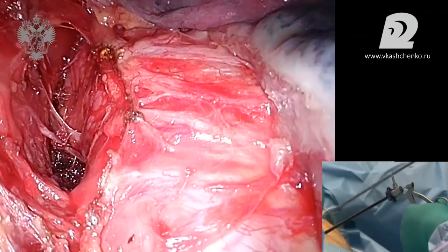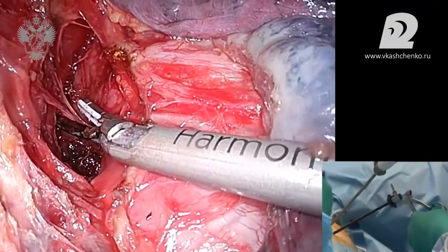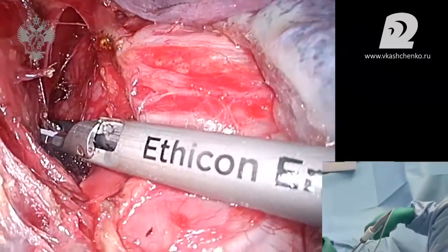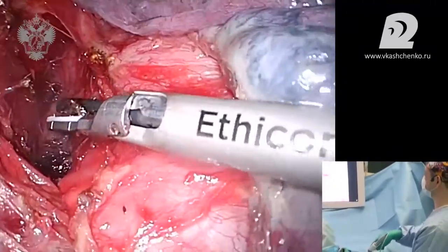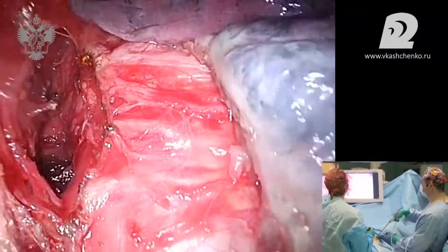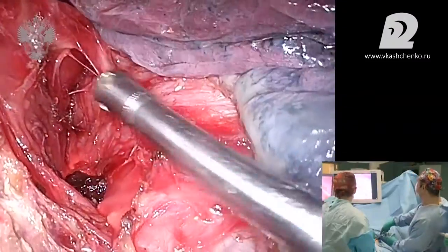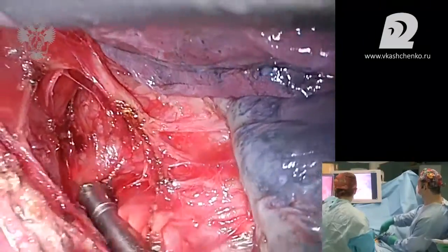Now, in the prone position, there are a lot of advantages. You don't have to turn the patient, and the bifurcation area is very good. The blood doesn't get into your way because it pours down. But my anesthesiologists do not like patients in the prone position first. Second, I have a habit of operating patients. It's lobectomy, thoracoscopical, in this position.